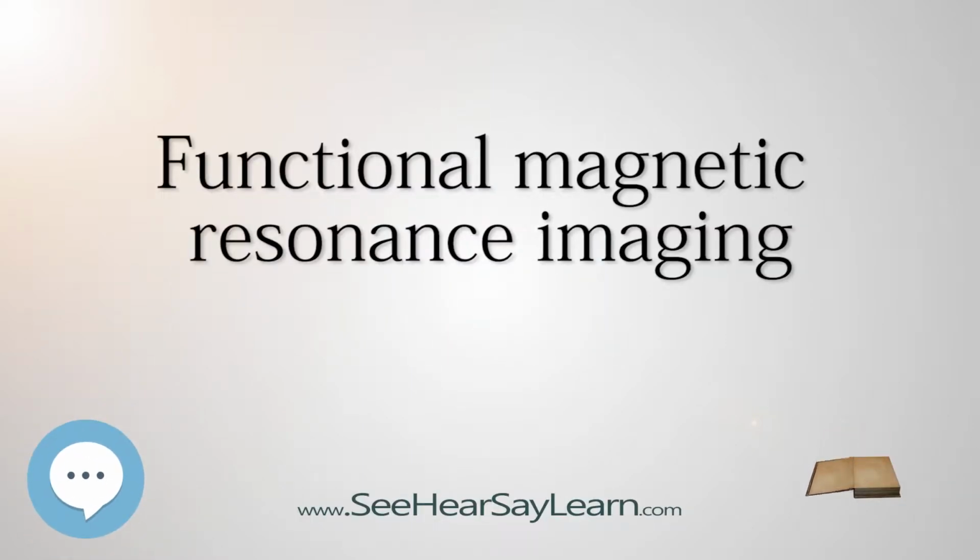Functional magnetic resonance imaging, or functional MRI (fMRI), measures brain activity by detecting changes associated with blood flow. This technique relies on the fact that cerebral blood flow and neuronal activation are coupled. When an area of the brain is in use, blood flow to that region also increases.